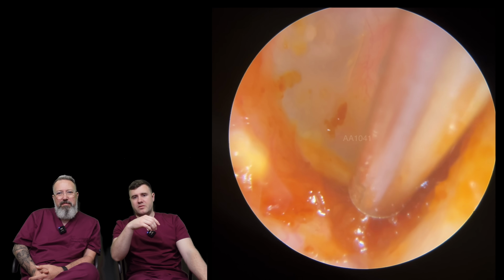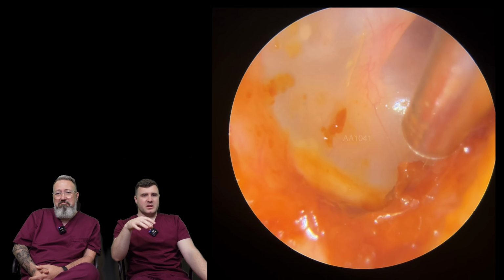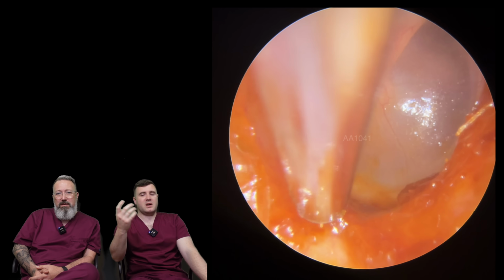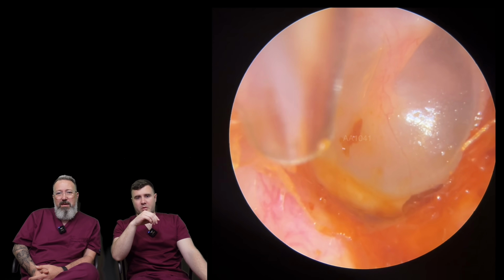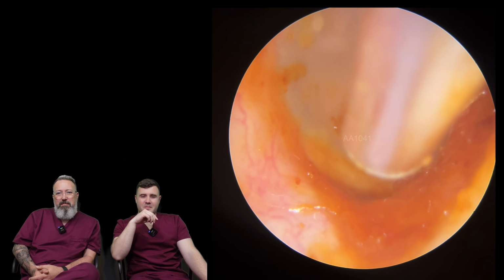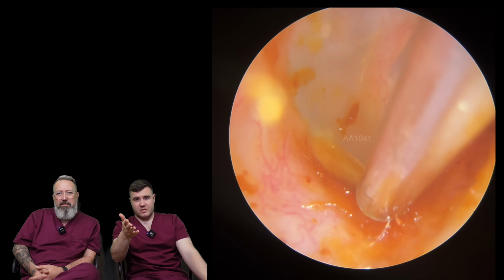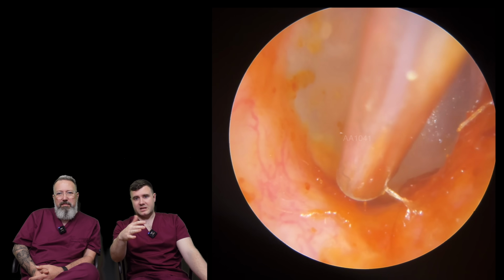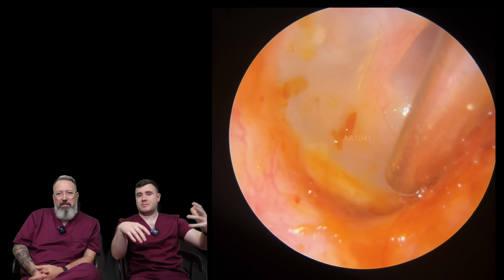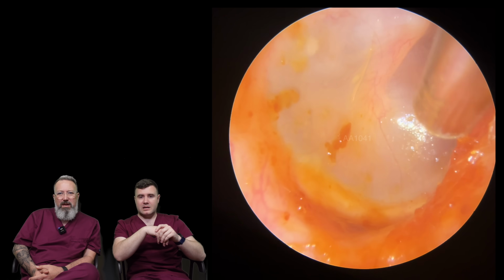But again, I know we've always said that we're not overly concerned about these little bits because they will eventually just make their way out with showers, baths, if you go swimming. But we're just trying to get away the worst part, a little tiny bit there. You've got to go really, really close to the ear canal, and you can see some of it's actually resting up against the eardrum. What I thought was going to happen was it would all start peeling like a big flap of skin, but it's literally just coming away in little tiny spots.